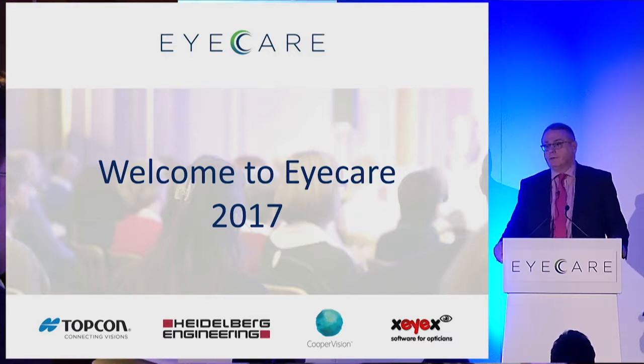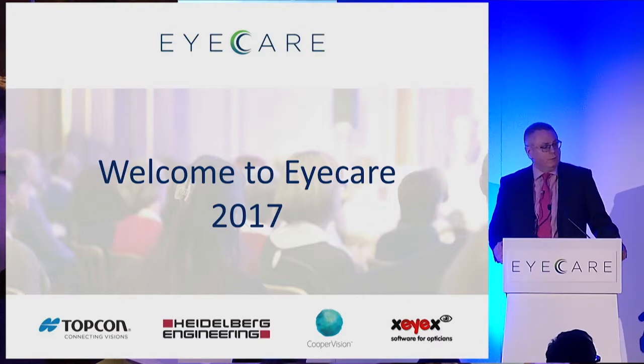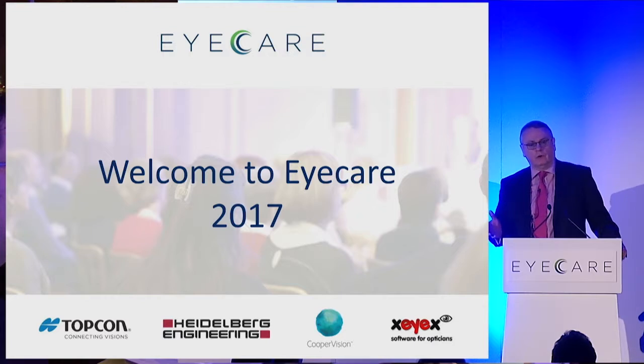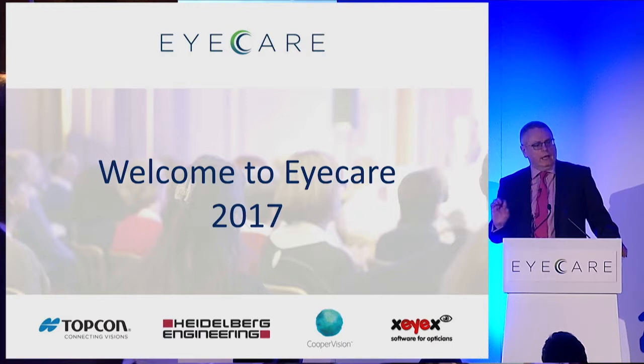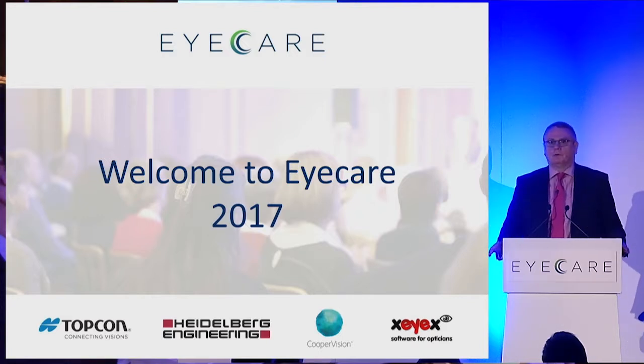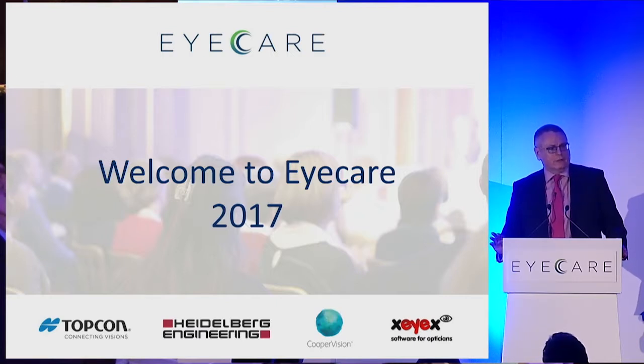We've got a variety of different macular pathologies to review, but before we start that, what we will do is go through what is normal to start with. I think it's important to review normal OCT anatomy and also a very straightforward approach to macular assessment. In doing that, we're going to scan one of my colleagues, Nick Timms, who's kindly volunteered to have his eyes scanned. All of our subjects are undilated. Obviously, we didn't want to put drops into people's eyes if they've then got to travel home from this meeting. It seemed a little unnecessary.